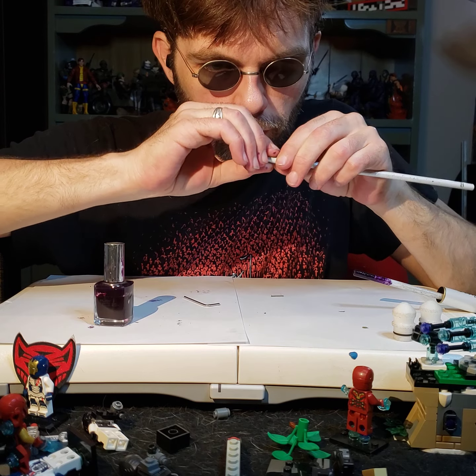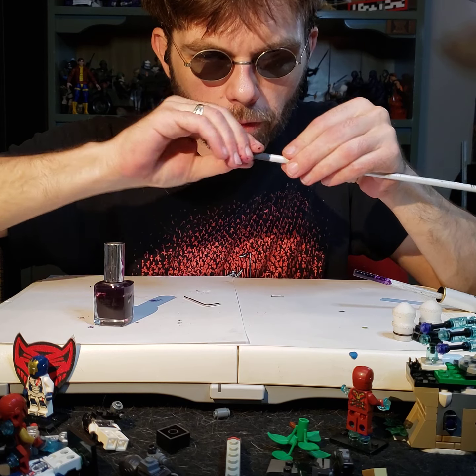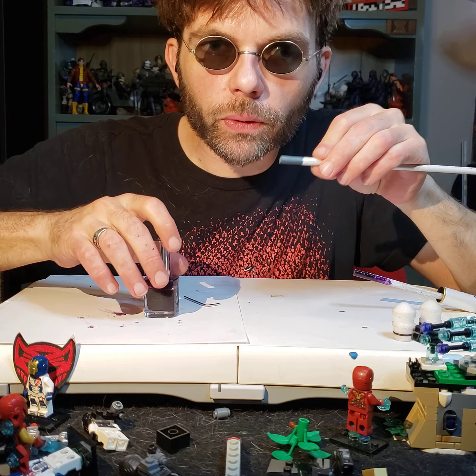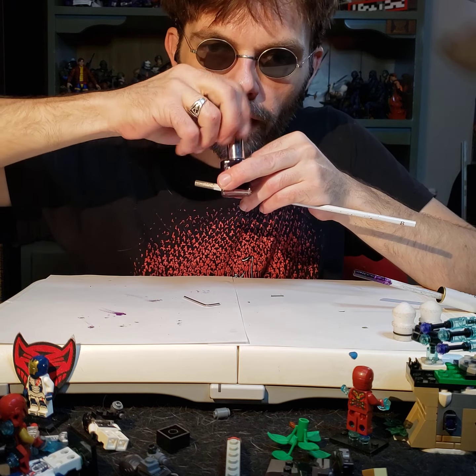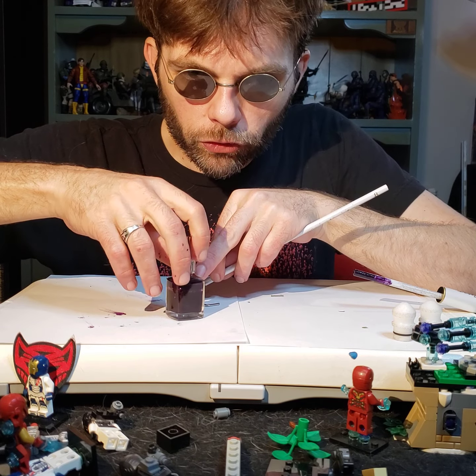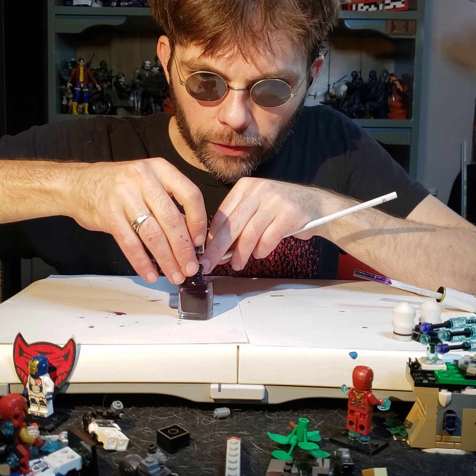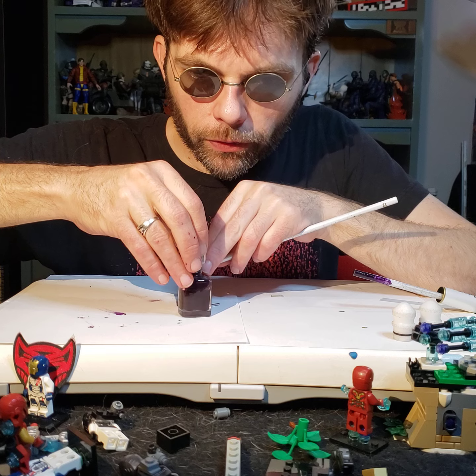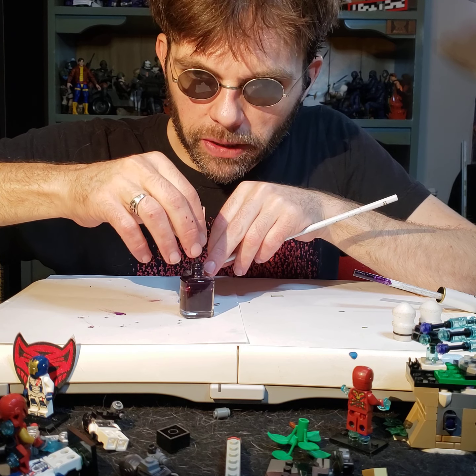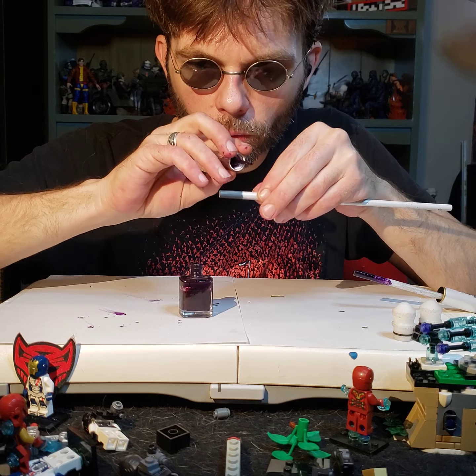So we're going to move our fingers up, make sure that we've actually figured out the location we intend. Plan, plan, plan before action. That is a blind person's motto. At least that's my motto. Plan 3 times, then act, because trust me, nothing ever goes according to plan. But if you've planned for the worst well enough, then you can at least be prepared when things go awry.